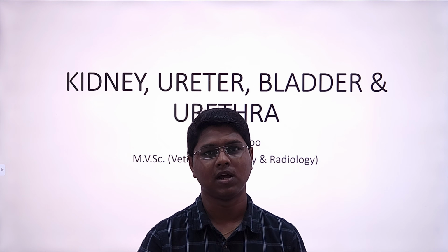So today I welcome you to another lecture on the radiographic pathology. Today we will be discussing the excretory system, the kidney, ureter and the bladder and then the urethra.